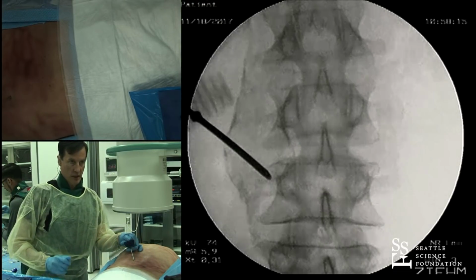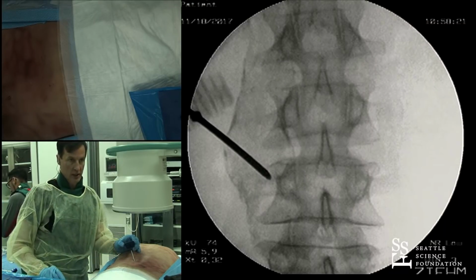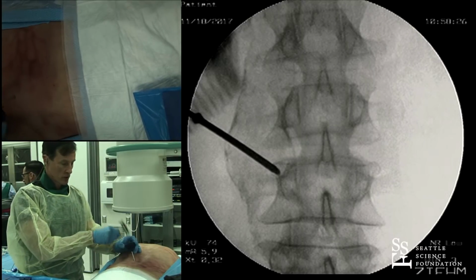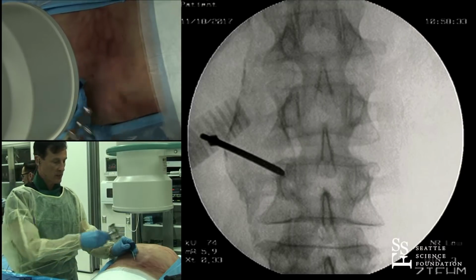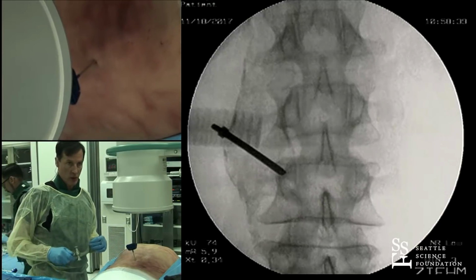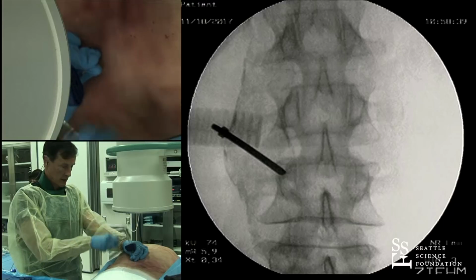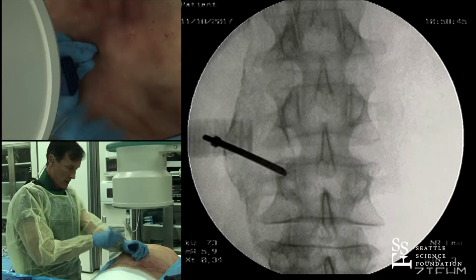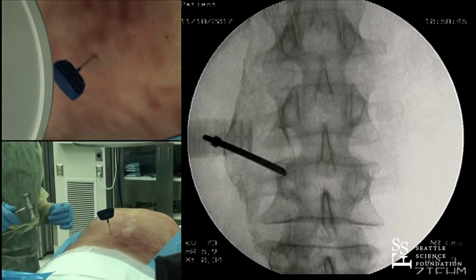Go down until you hit bone, and the targets on this are going to be the 10 o'clock and the 2 o'clock position of each pedicle, so left and right respectively. So you go down, tap, tap, and you're going to give this a test and see how hard the bone is. All right, so bone is pretty darn hard.